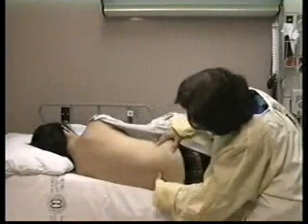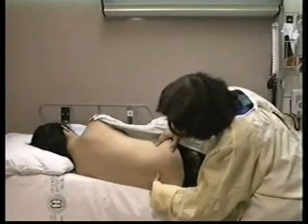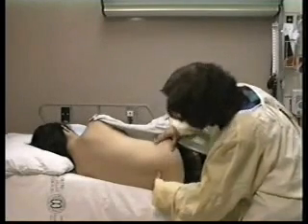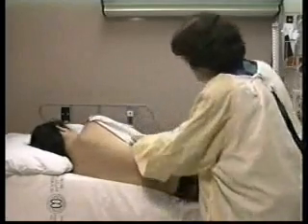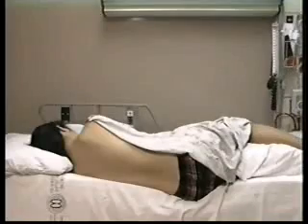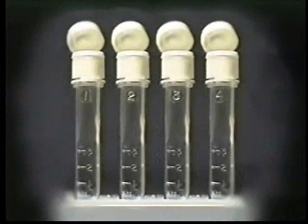Reduce the chance that the patient will tire by letting the patient relax while you set up. Be sure that the equipment is set up for easy access. If you have no assistant, set up as much beforehand as possible. For example, open the cap of the lidocaine, open extra gauze packages, put on sterile gloves, remove any excess material from your field, and set up the vials.